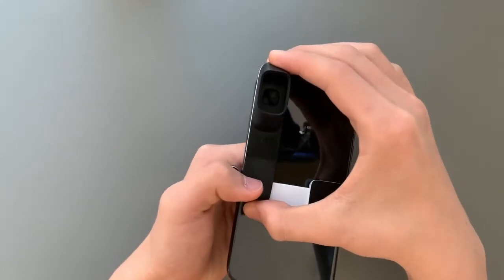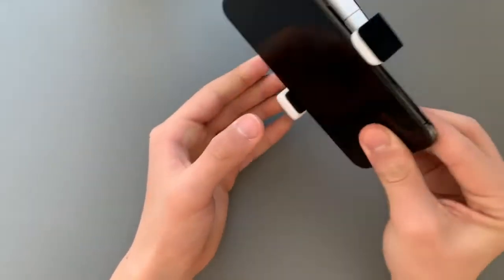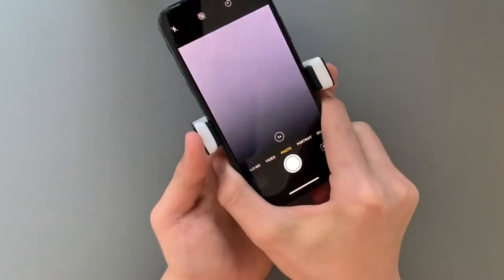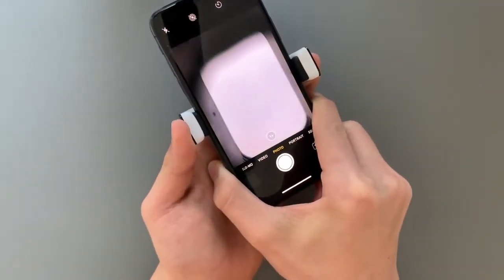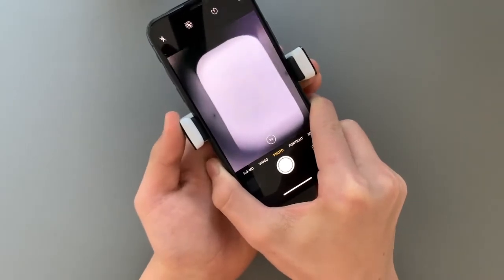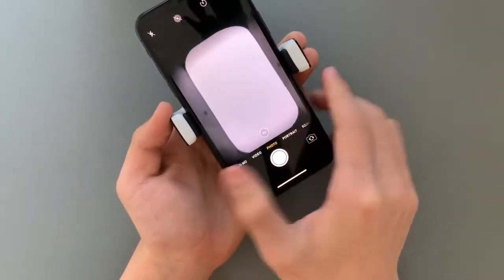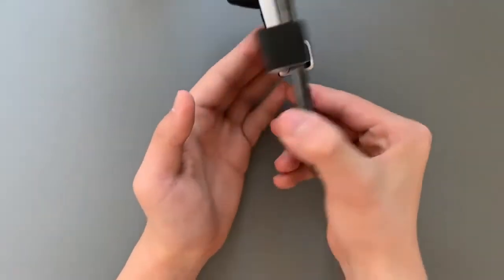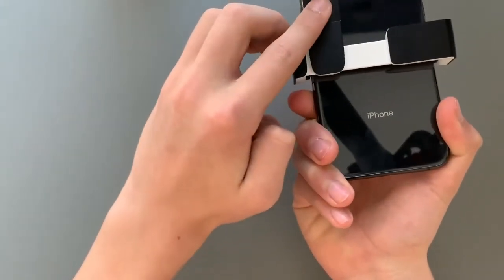To vertically center the dermatoscope over your phone's main camera, which is typically at the top left, simply start your phone's camera app and make any fine adjustments. Now is a good time to zoom in to get it just right, but be aware that on some smartphones, zooming in too far will switch to the secondary camera, which you want to avoid.